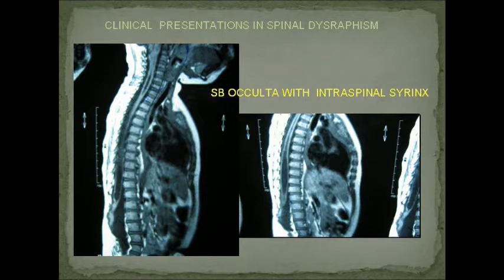Another boy with an intraspinal lesion, an insignificant outside lesion, but you can appreciate the very large syrinx inside the cord here, a bit of syringomyelia, also higher up. His skull was okay, there was no hydrocephalus. Many a time a syrinx like this will be secondary to hydrocephalus.